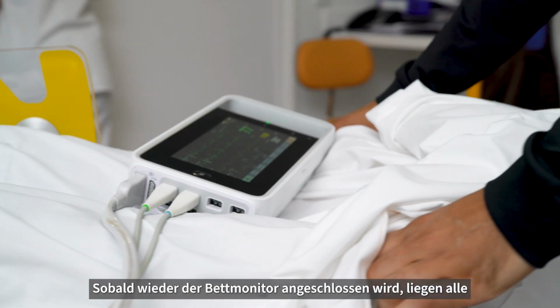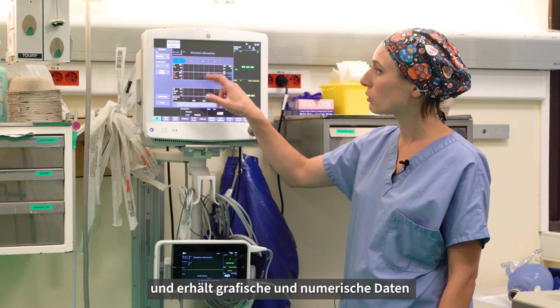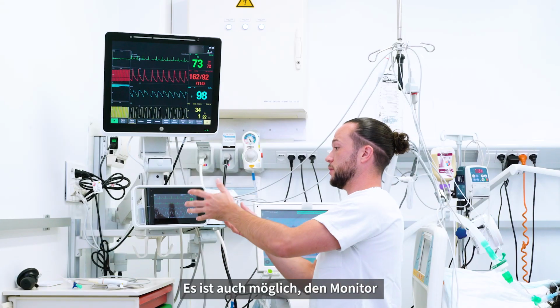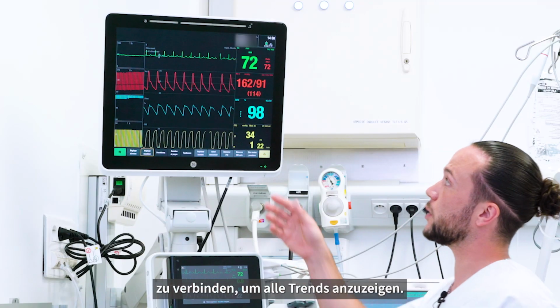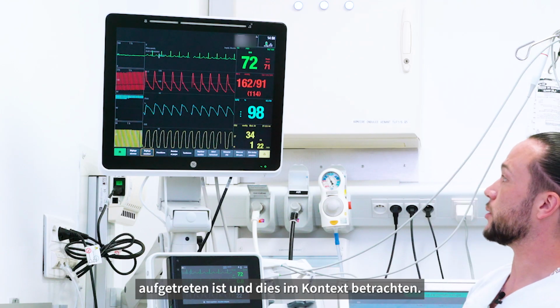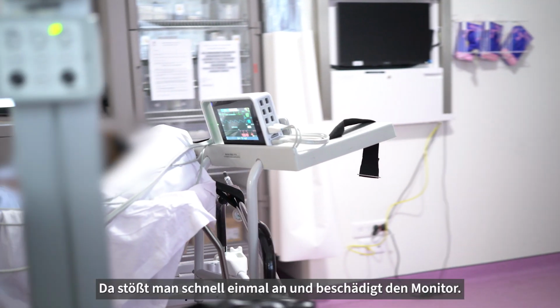As soon as we reconnect it to the bedside monitor, we have the data log. You can press on the trends and retrieve graphical and numerical data of what may have happened previously. We are able to connect the monitor that comes from the emergency department to this bedside monitor and review all the trends. For example, we can see here when there is desaturation, when there is hypertension, and put things in context.